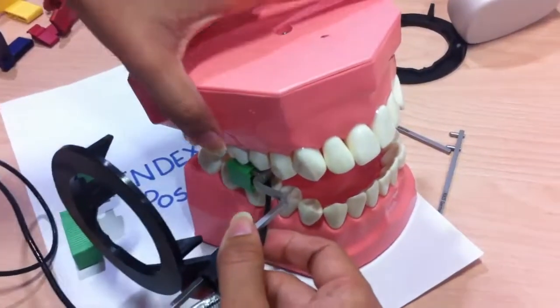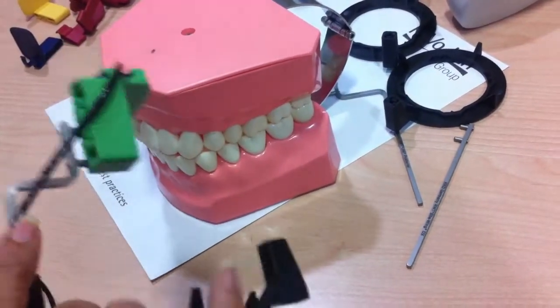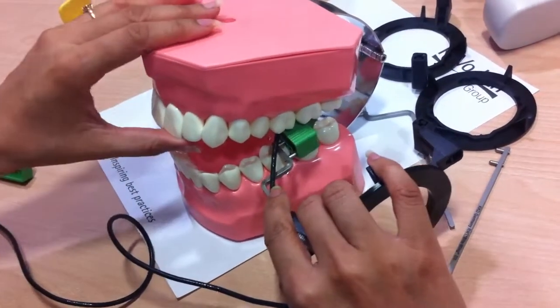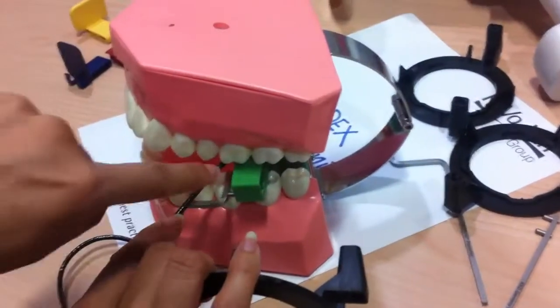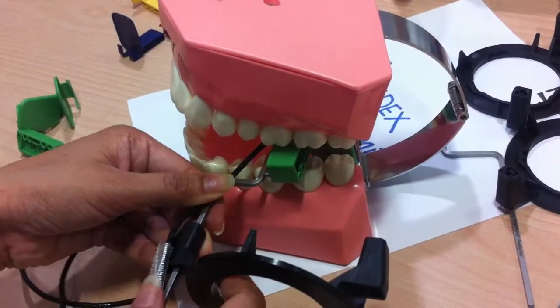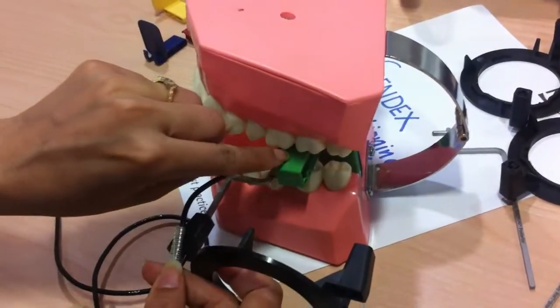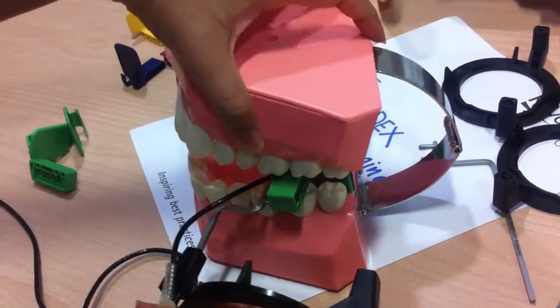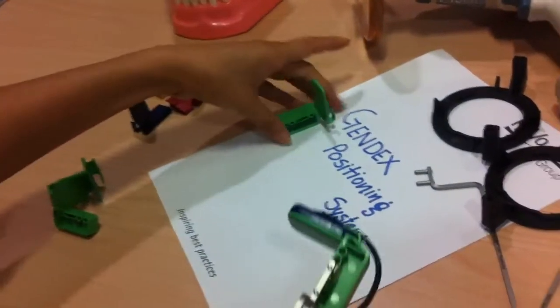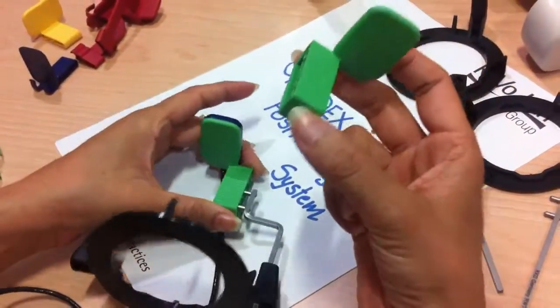This vertical endo configuration is for the upper right and lower left. The same configuration works for the lower left as well — the sensor is exactly aiming the tooth and the patient is not biting where there is a file. The other vertical configuration is for upper left and lower right.